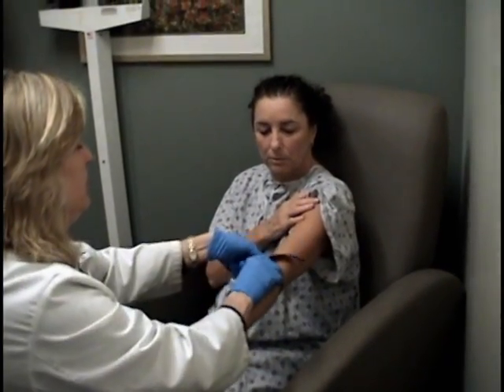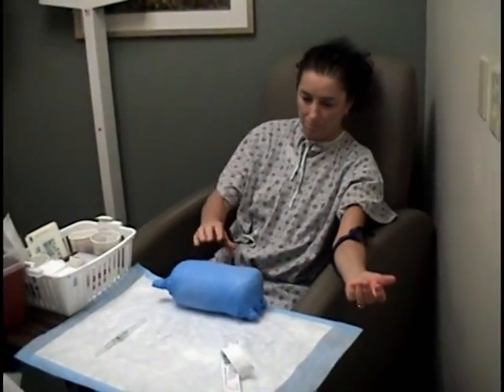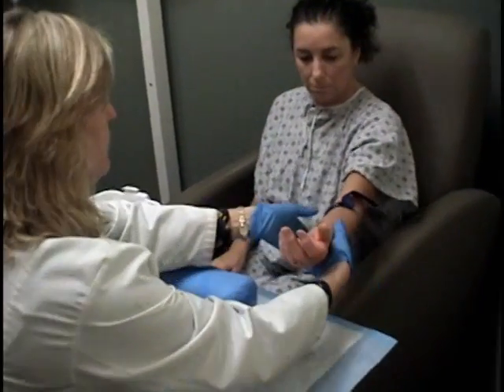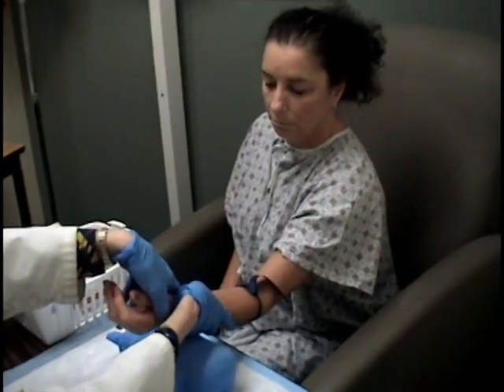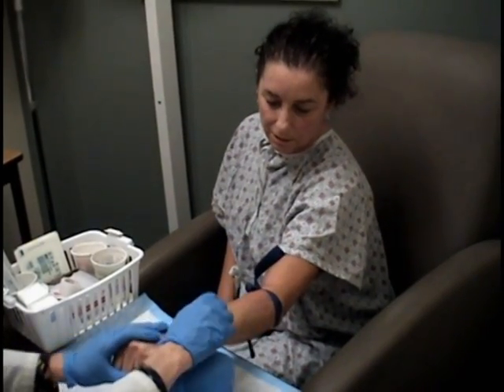We will place an IV in your hand or arm. This IV will be used to inject two isotopes for this procedure as well as Lexascan, adenosine, or dobutamine. These pharmaceuticals are used if you are unable to exercise on a treadmill for the stress portion of this test.